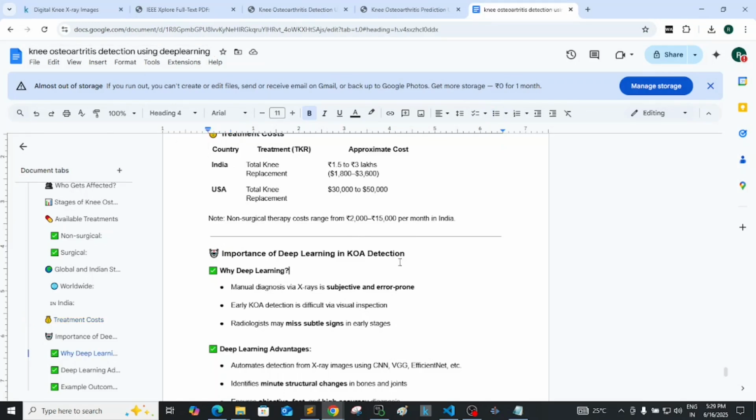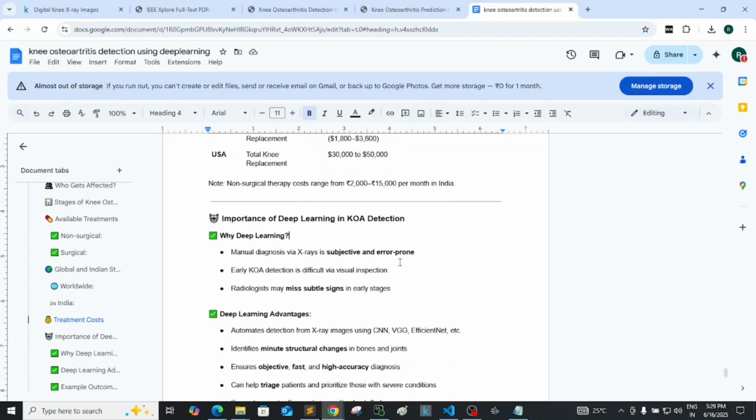That is the main aim of the project. We want to make sure the disease is detected before the final stage, so treatment can be done easily, with less money and less pain for the patient. Treatment success will be 100% if you treat it at stage 0, 1, or 2, but for stages 3 and 4 it is a bit hard.